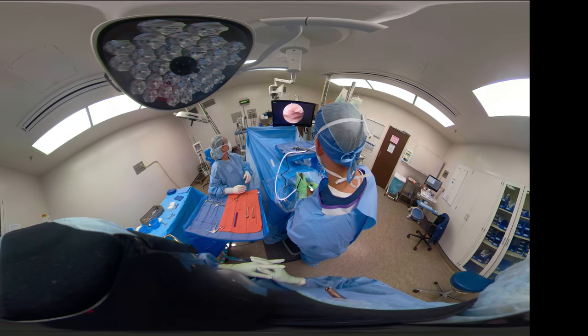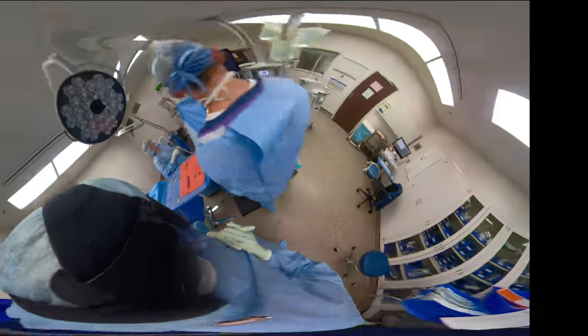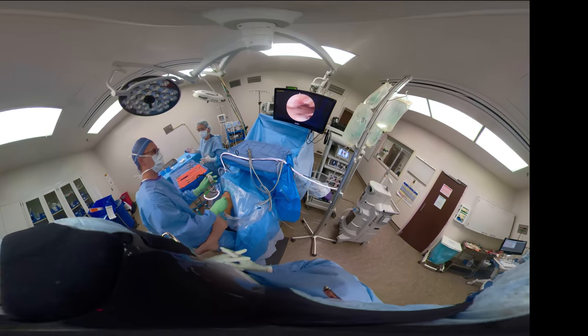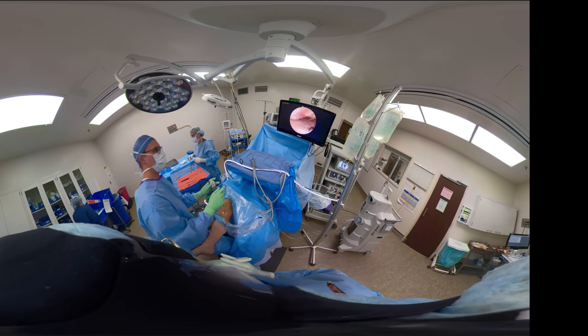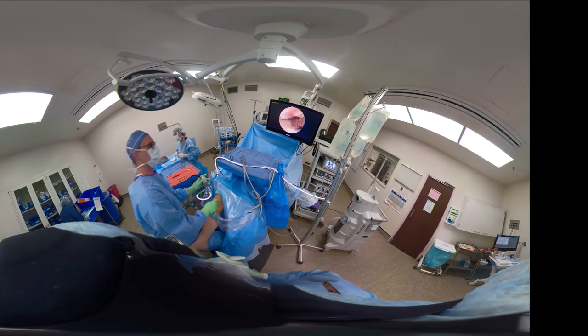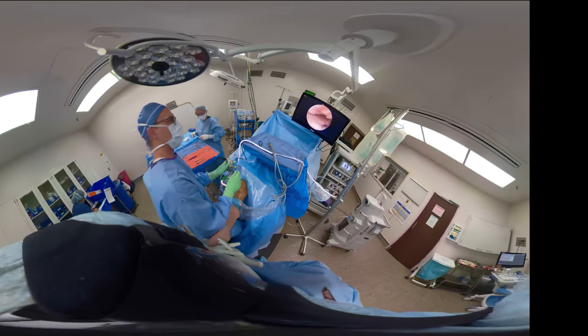The size of the defect will dictate whether we do a microfracture or do we stage him for some other articular cartilage procedure. So you can see the patient's leg is in varus. The resident is leaning into him, and then this is this very large defect in the lateral femoral condyle, measuring 2 by 1 centimeters. Meniscus looks okay.